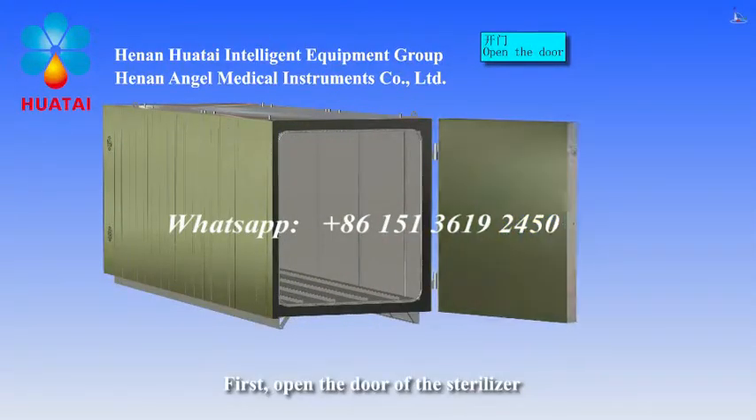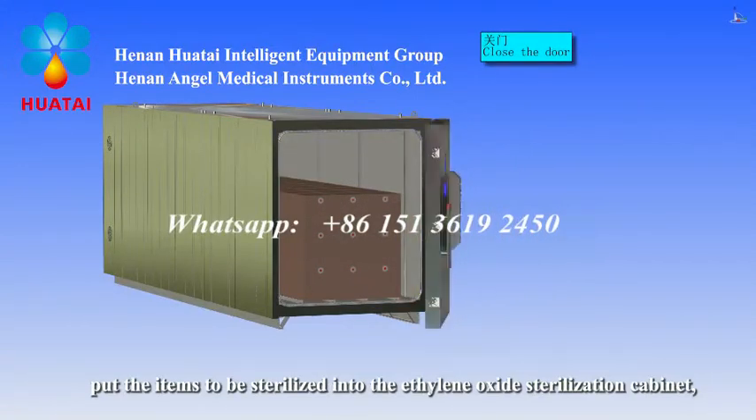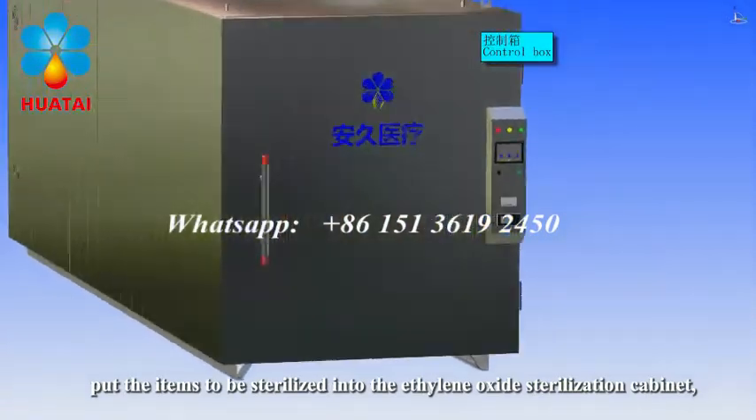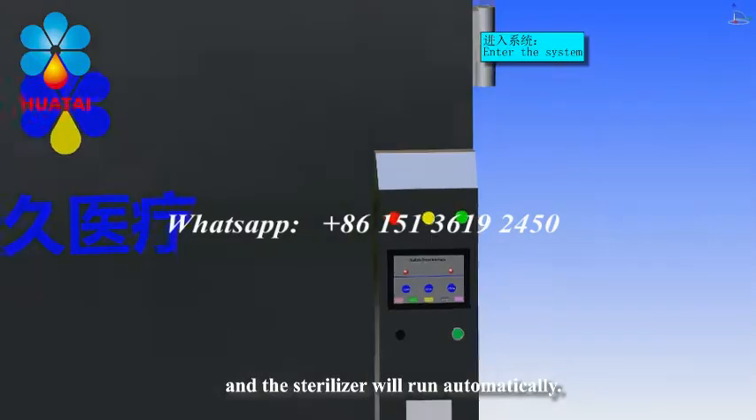First, open the door of the sterilizer. Put the items to be sterilized into the ethylene oxide sterilization cabinet. Then operate the sterilizer panel to start sterilization, and the sterilizer will run automatically.